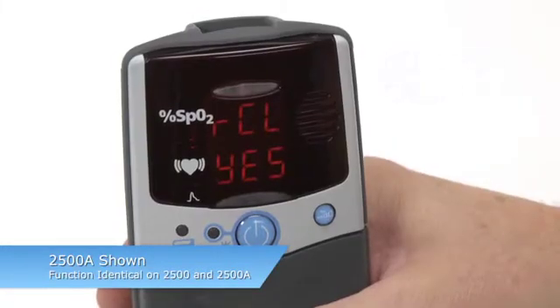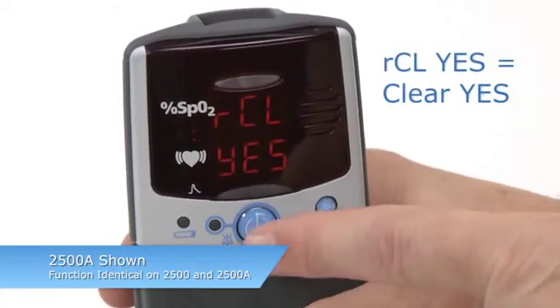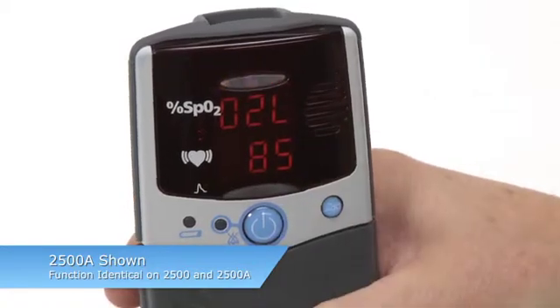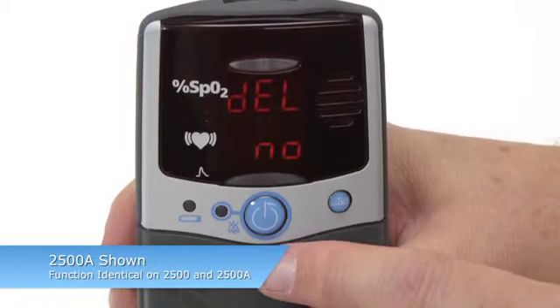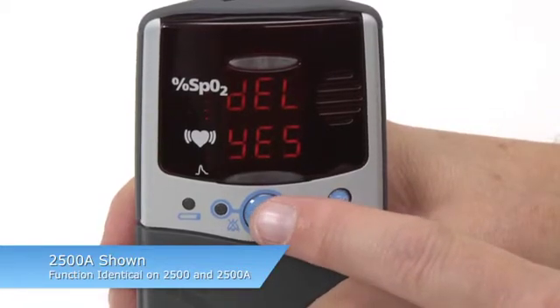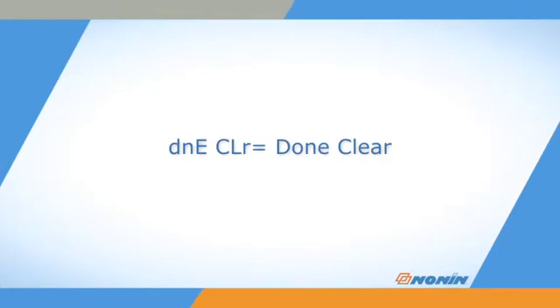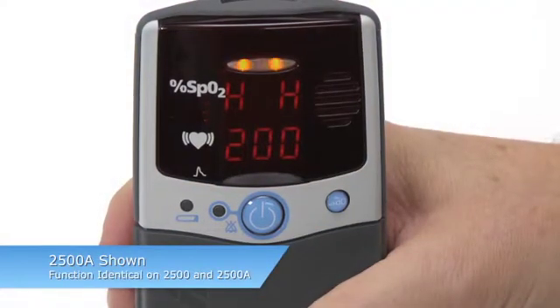To clear memory, press the ADVANCE key until you see CLEAR, YES. Then press the ON-OFF key to perform that memory function. Delete will appear. Confirm that you want to clear by pressing ON-OFF again.